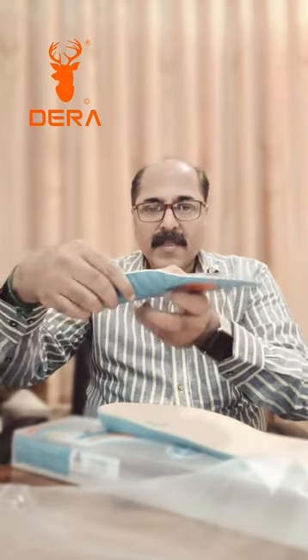These are gel features — metatarsal area gel and heel gel. This provides great arch support and great cushioning.